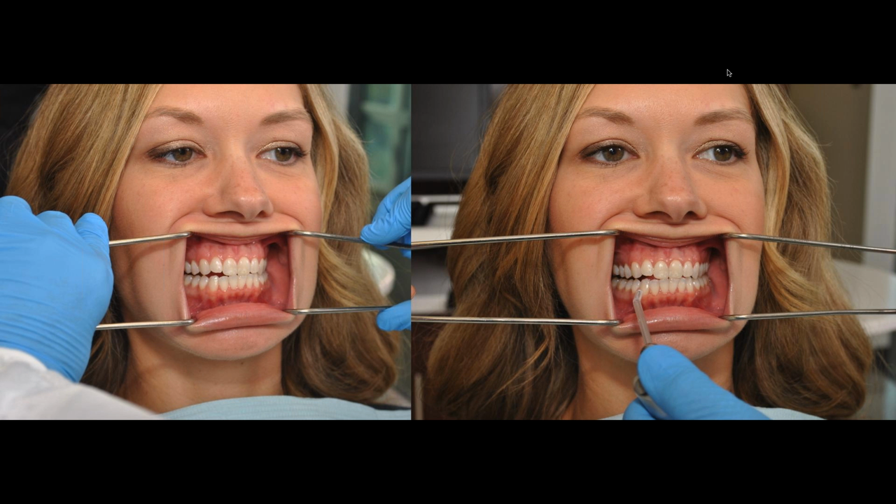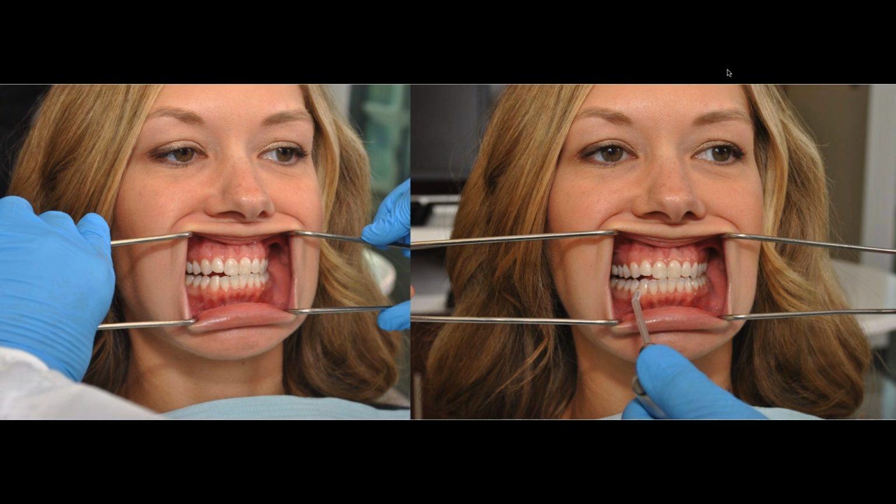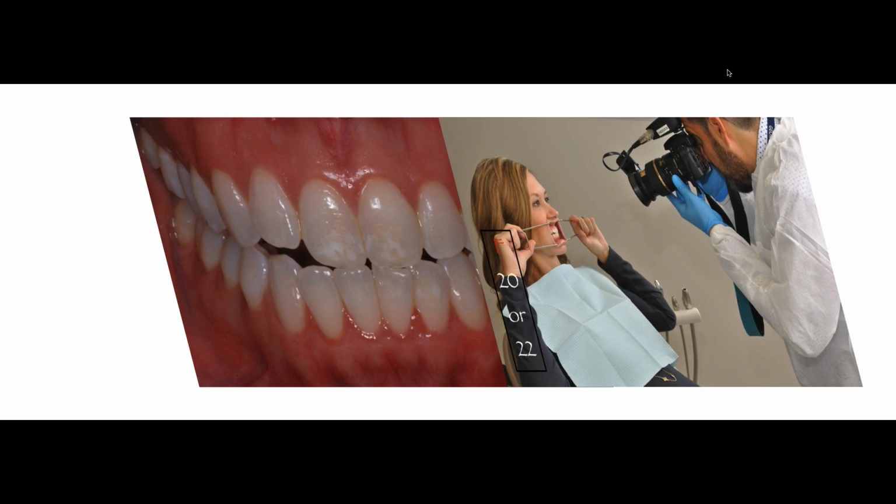So we have the patient come edge to edge. We place the retractors, we help them retract, and we have them then hold the retractors. Then we blow air on her teeth, so we get rid of all the saliva. And we ask our patient to take her tongue all the way to the back, so that we don't get the tongue coming through the teeth. This is a very important tip. We don't want to see any tongue on this photo. We just want to see the retracted lip. We want to see the teeth.